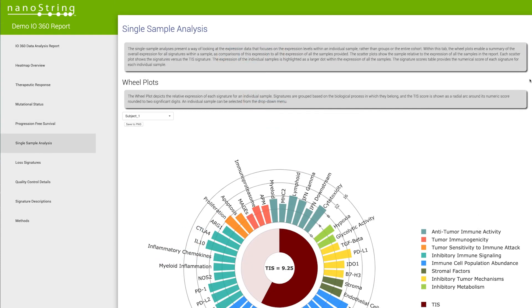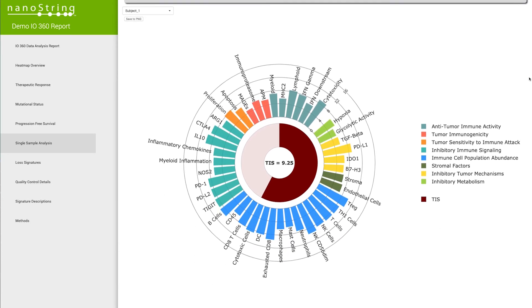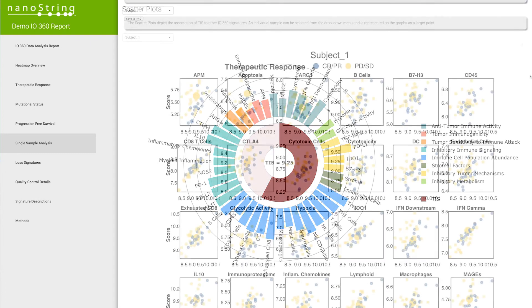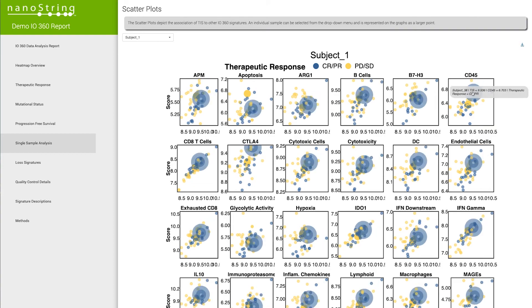The hallmark of the IO360 data analysis report is the single signature wheel plot. It provides a gene expression fingerprint for each sample, giving an overview of all signature scores for that particular sample. Scatter plots are also provided to view specific samples in the context of the larger dataset.